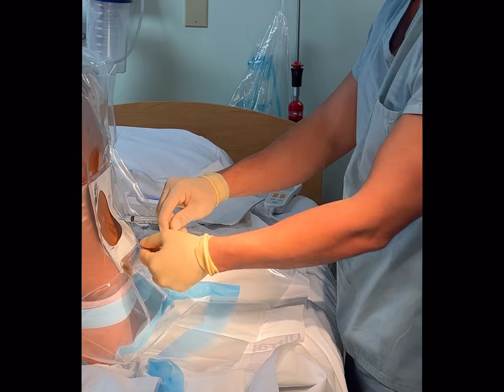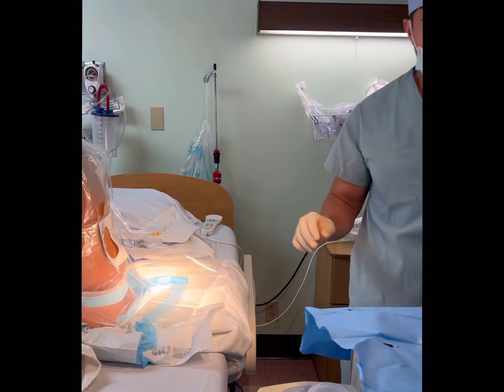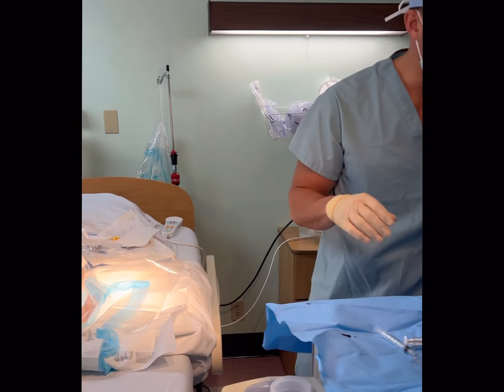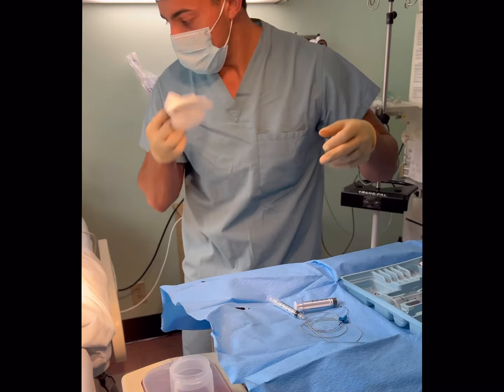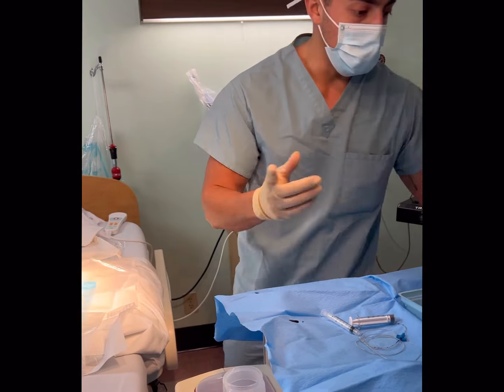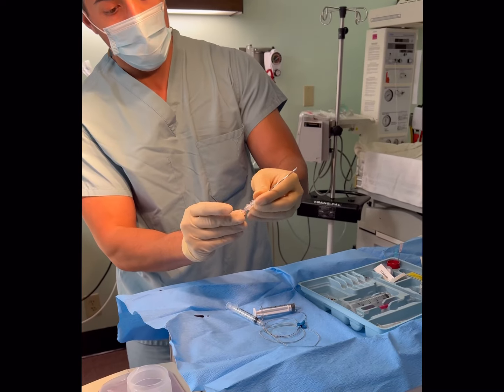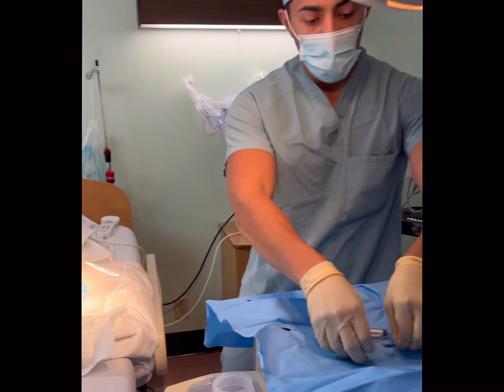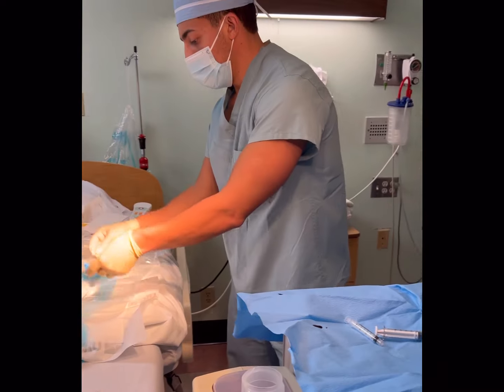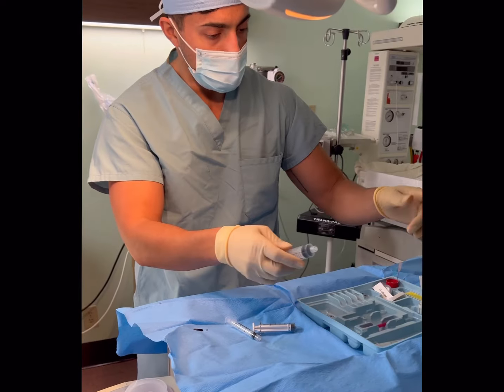I'll just continue with the numbing. She's going to be numb now — she shouldn't feel much, she will feel some pressure. Here's my Tuohy — 17 gauge Tuohy with a stylet. I'll put that right there and I'll bring over my catheter. While that numbing medicine is working, I'm going to draw up my test dose.